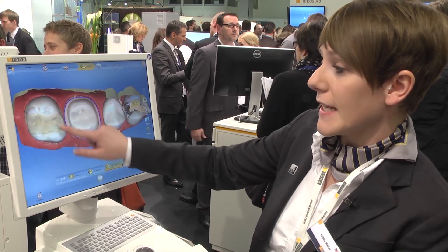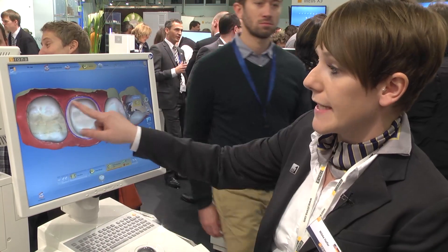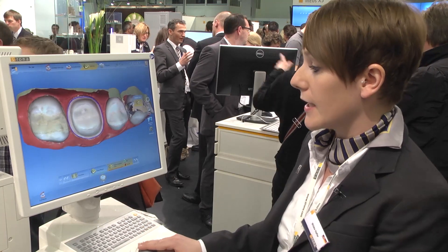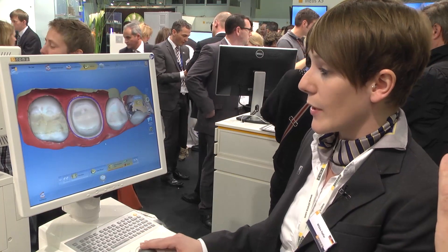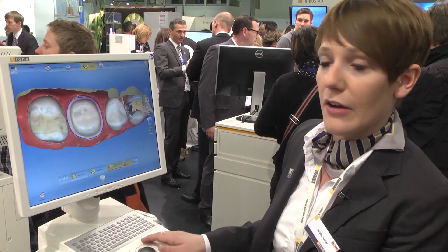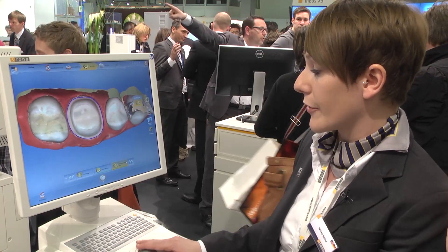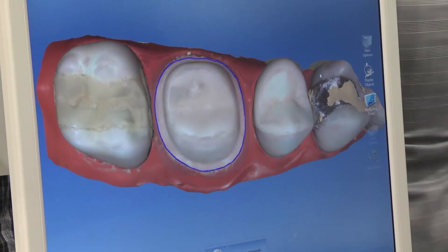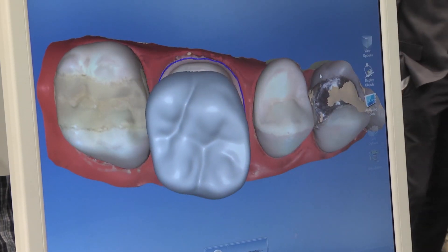Now we fix the preparation line. You can see it here as the blue line — that's the preparation margin. I define the insertion axis to ensure we have every piece of information about the preparation, then click OK to confirm.